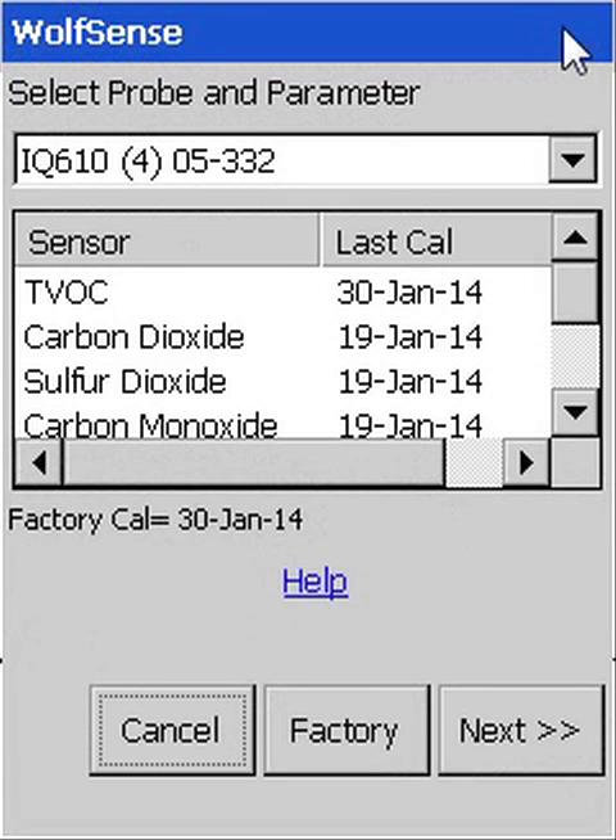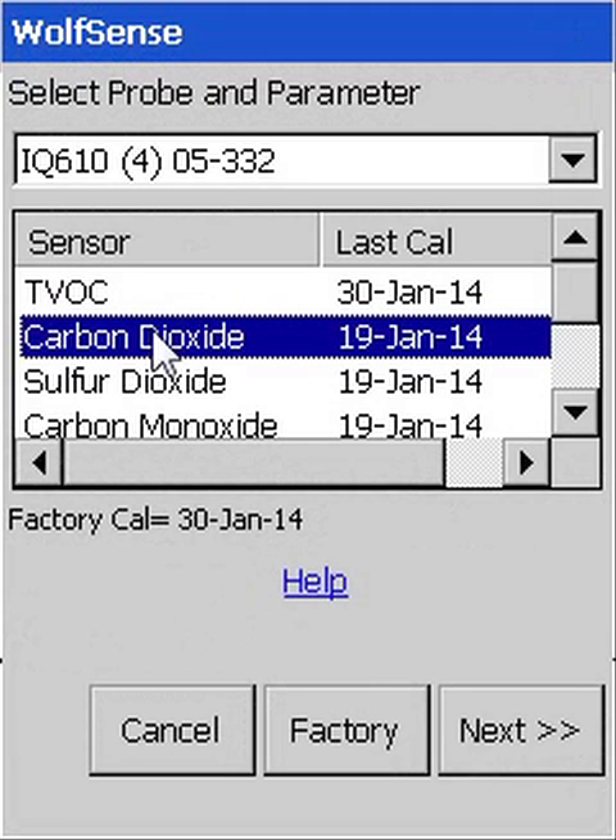The probes that are connected and their sensors available for user calibration are displayed. After selecting the correct probe or internal sensor when more than one is available, select the parameter to be calibrated. Here, we'll calibrate carbon dioxide.